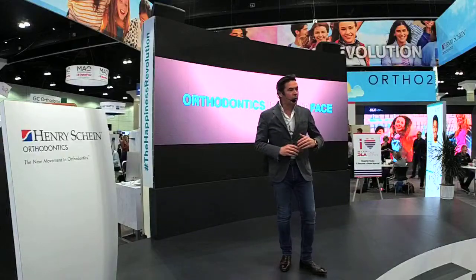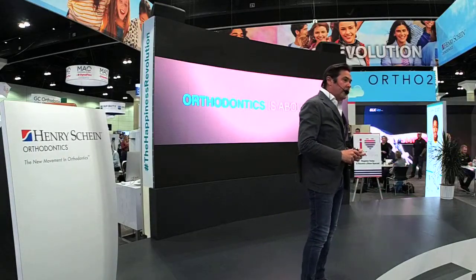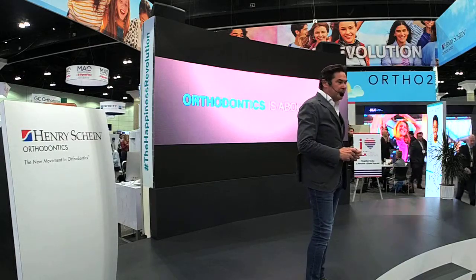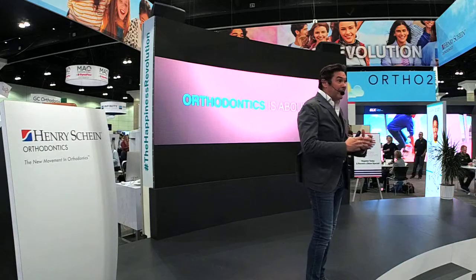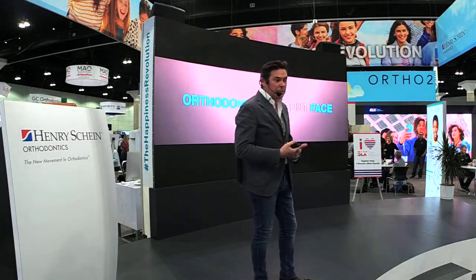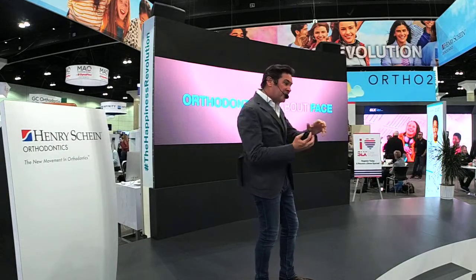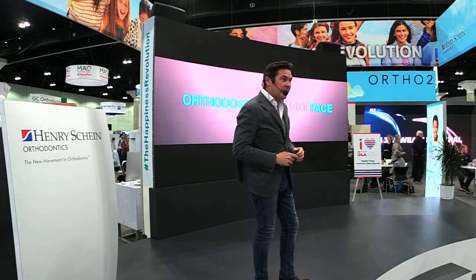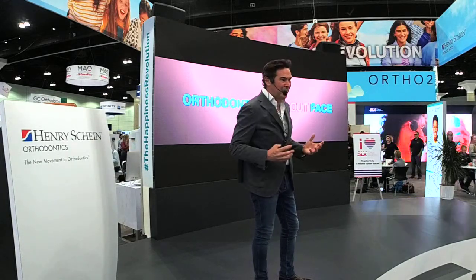approach the orthodontic treatment when we face treatments that could be complex with aligners, for instance. Aligners is a perfect technique. It's a perfect element that could perfectly substitute the brackets. But in many cases, especially when there are sagittal discrepancies, the aligner is not efficient enough.